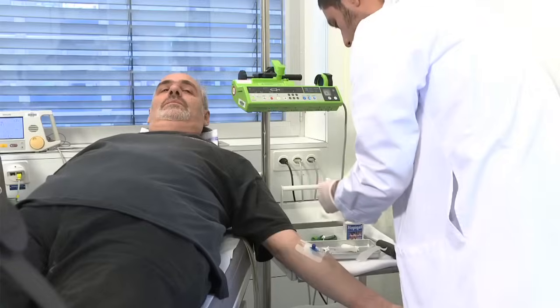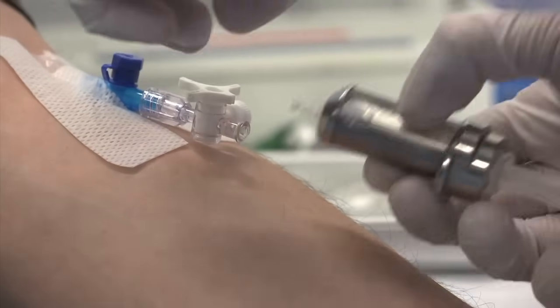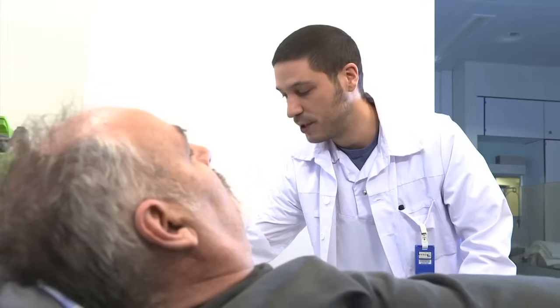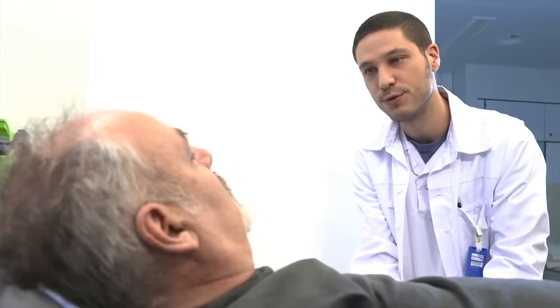Après la réalisation de ces premières images, une autre injection du traceur est effectuée pour la série d'images du cœur au repos. Je vous injecte le produit, qui est le même que tout à l'heure. On fera les images dans une heure. Vous pouvez disposer librement de votre temps en attendant.